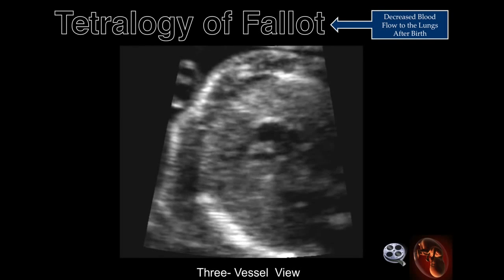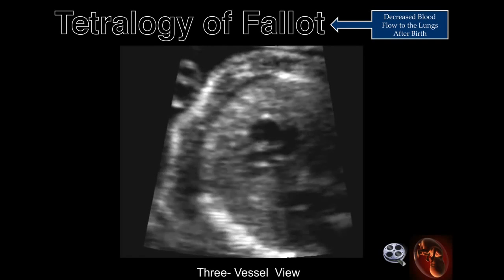This cine clip illustrates the dilated aorta with a smaller pulmonary artery lying beneath it.